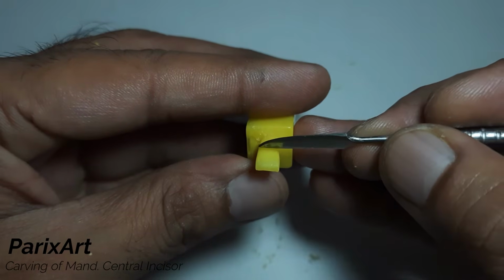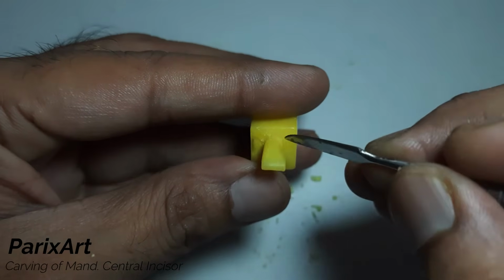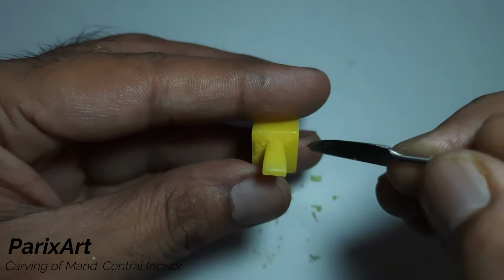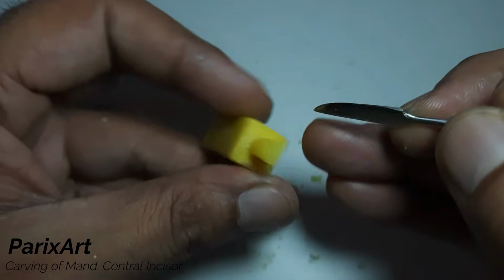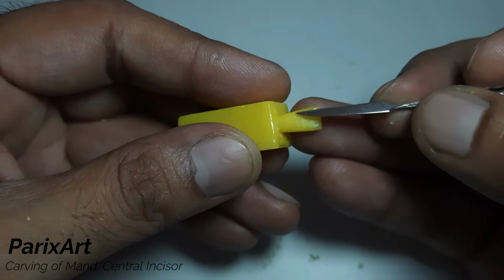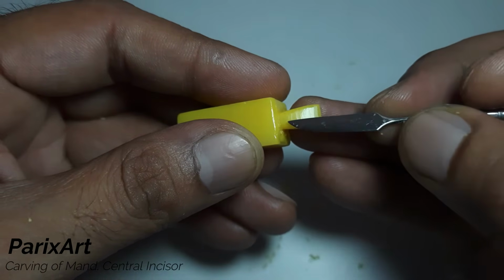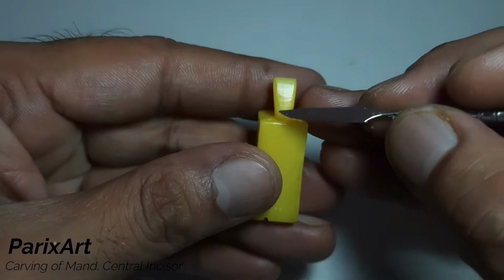As we go to the middle, it becomes slightly convex. It becomes convex mesio-distally. Further, it becomes more convex at the cervical. So this part will be made flatter, like this. This part is slightly convex. Just round off the line angles to achieve the required contour.